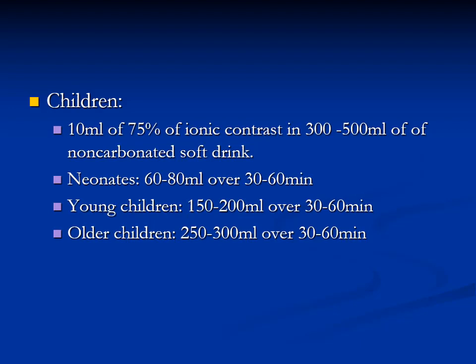Children: 10 milliliters of 75% ionic contrast in 300-500 milliliters of non-carbonated soft drink. Neonates, 60-80 ml over 30-60 min. Young children, 150-200 ml over 30-60 min. Older children, 250-300 ml over 30-60 min.